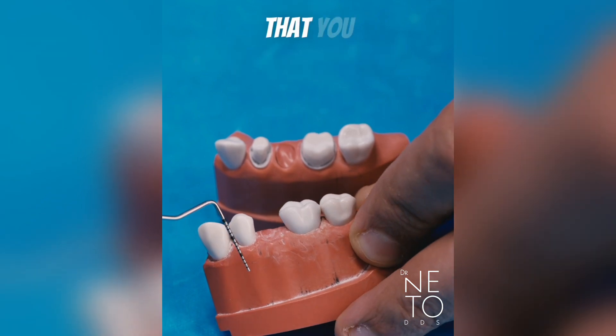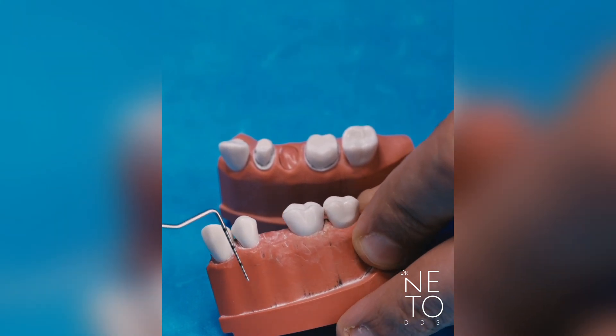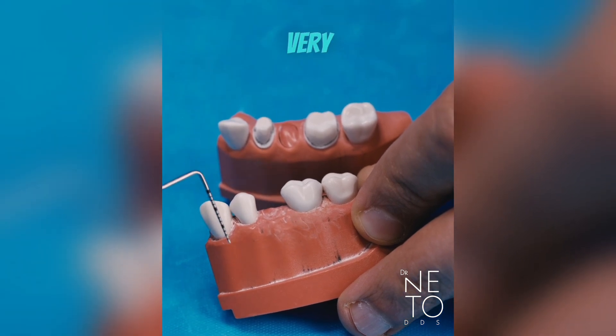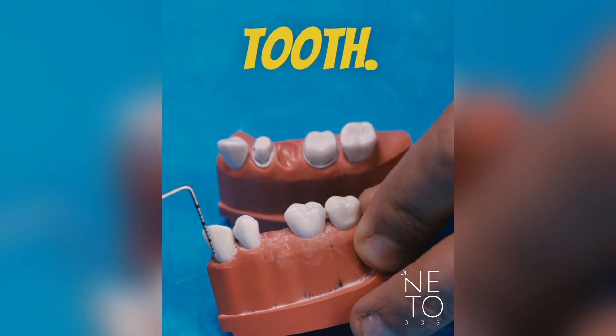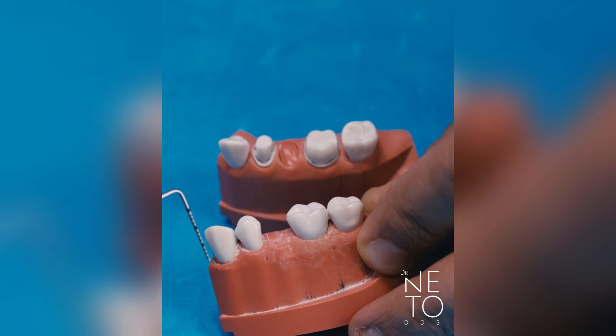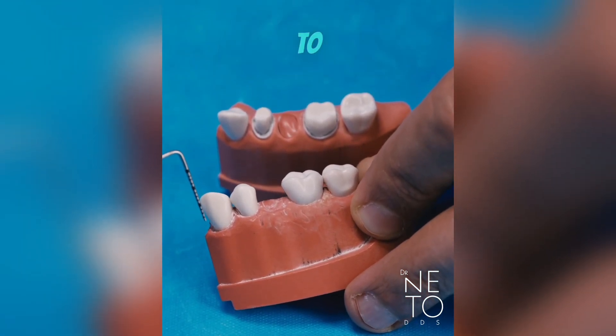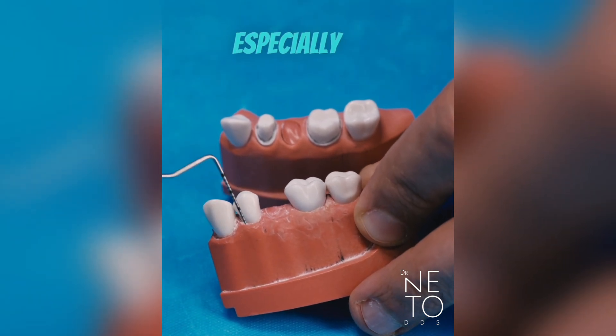It's important that you really get this line very straight down, very parallel to the long axis of the tooth. I'm going to give you a hint on how to get those lines straight down and parallel to the long axis of the tooth, especially for number five.